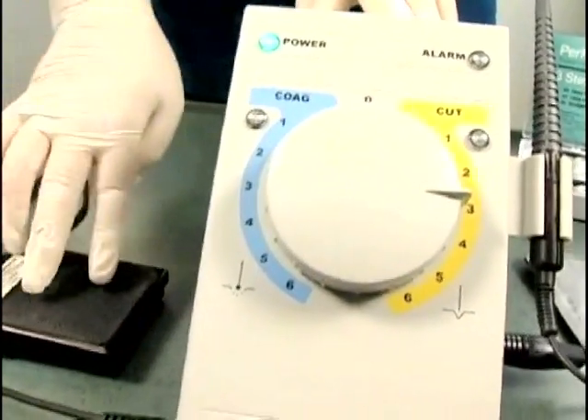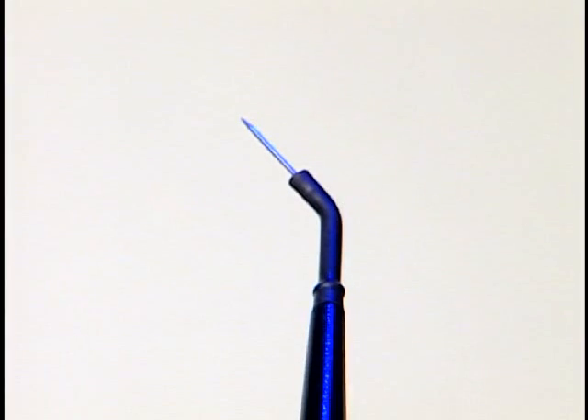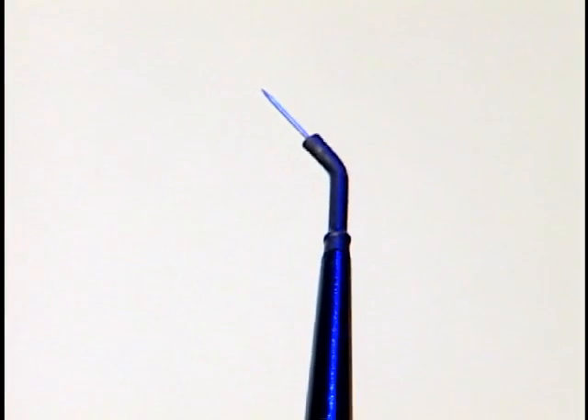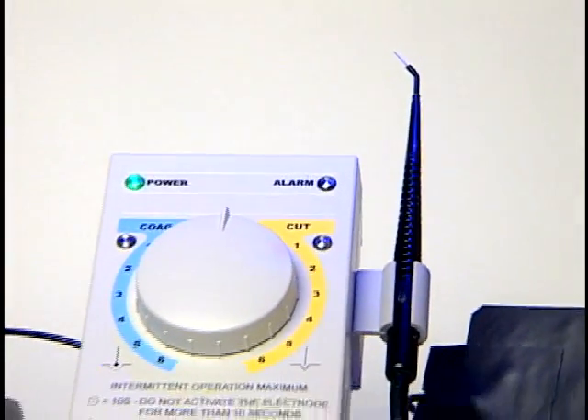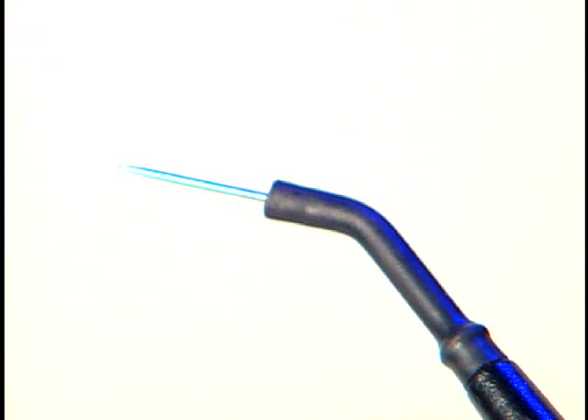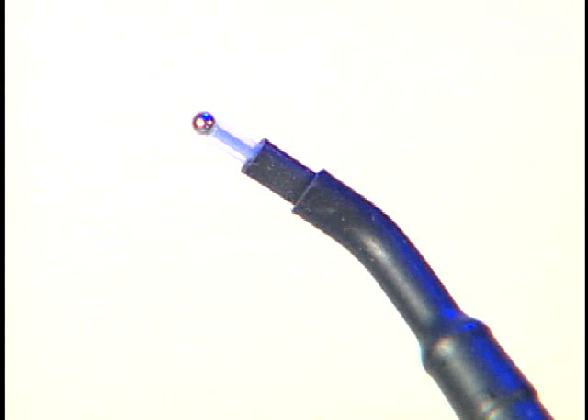Now the Perfect TCS 2 is ready for use. The Perfect TCS 2 uses three sterilizable electrodes: the straight knife electrode, the long loop electrode, and the coag ball electrode.